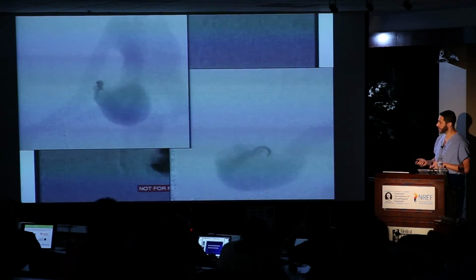So this is that embolization. Actually, this isn't that one, but this is one that doesn't go exactly how you want it. And what do you do when the glue starts to fly? So here's a microcatheter tip right by the point of fistulization. So look at this. This is not good. Glue's flopping in the breeze. So the right thing to do here is actually inject faster because it wants to fly away.